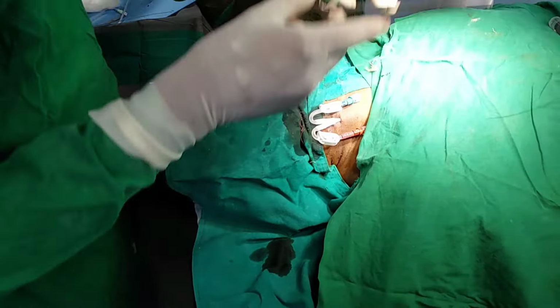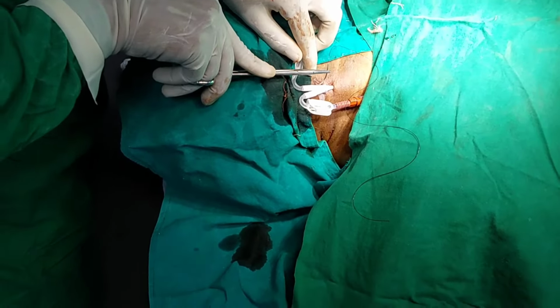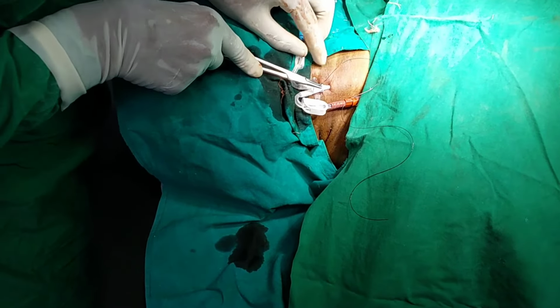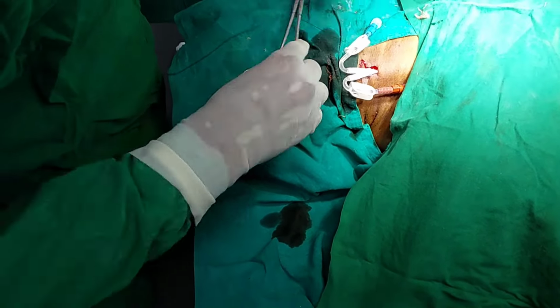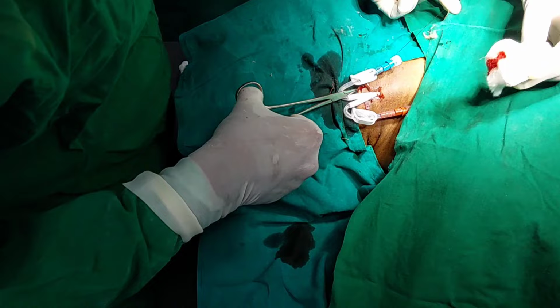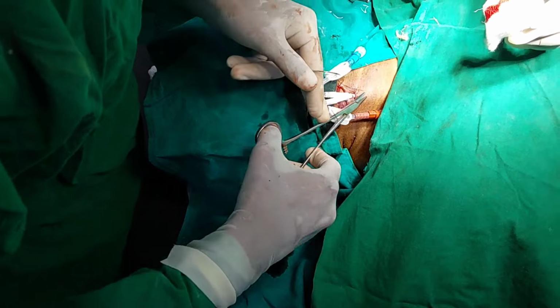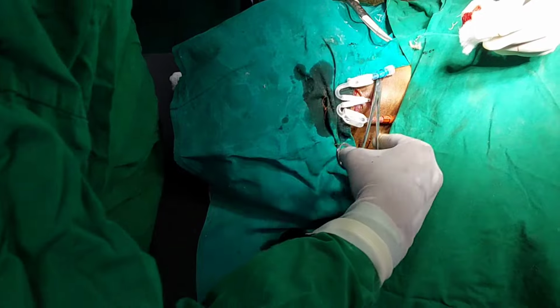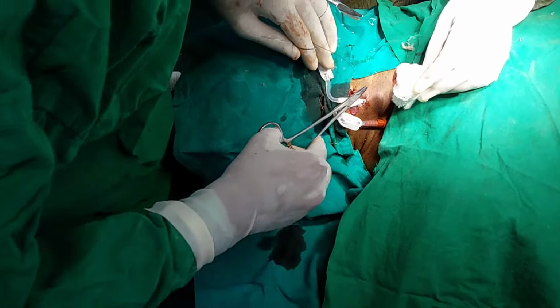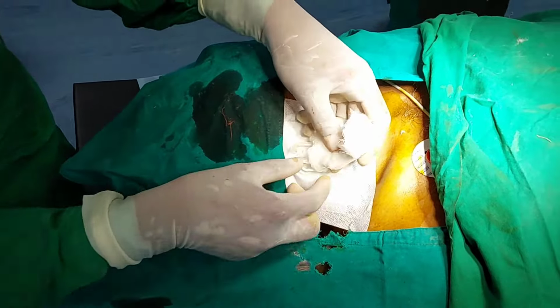After confirmation of the patency of both lumens, fix the catheter using non-absorbable suture material. Here we have used nylon 2-0. See, here the suture is being taken. After suturing, you have to apply a sterile dressing. The suture is taken over one side. The same suture is taken on the other side. Sterile dressing was done. Then cover the tip of the lumen with a sterile pad.